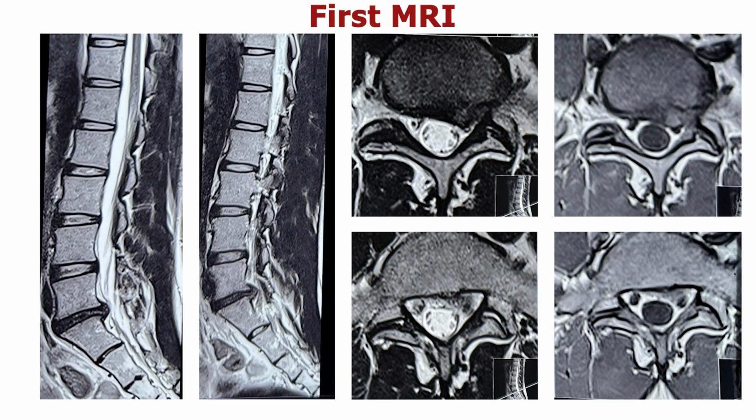So here this is a young male patient. He's an army personnel. He was having severe left-sided leg pain with a bit of list on the left side. The pain was there since the last 4 to 5 months. This was the first MRI, 4 months old, where you can see there is a disc prolapse on the left side, which is paracentral. But recently his pain is aggravated, so he is not able to do his routine work. As he's an army personnel, he has to do PT and everything. The pain has aggravated more compared to the previous findings.